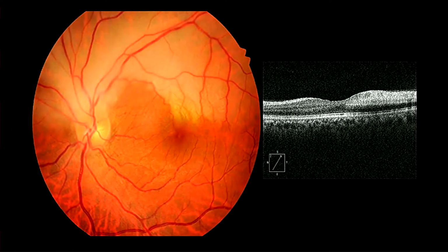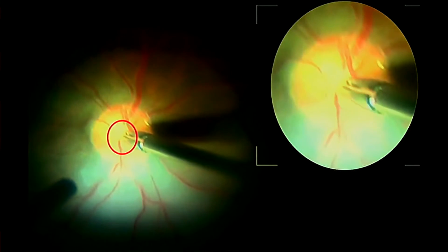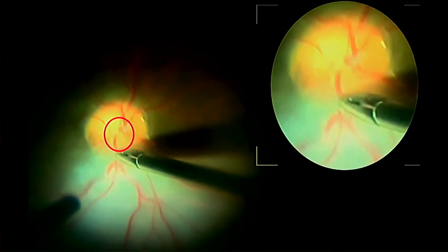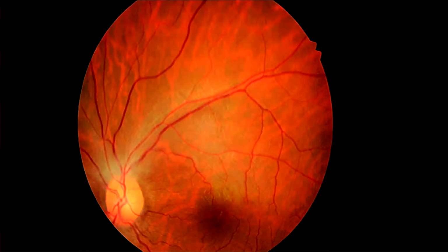In this other case of branch retinal artery occlusion having progressive visual loss, a low IOP vitrectomy was performed. The disc was dissected at the site of the occlusion. After direct massage of the artery, the thrombus can be seen migrating to the periphery. This eye recovered very well, with the vision improving to 6/6 by the 5th post-operative day.